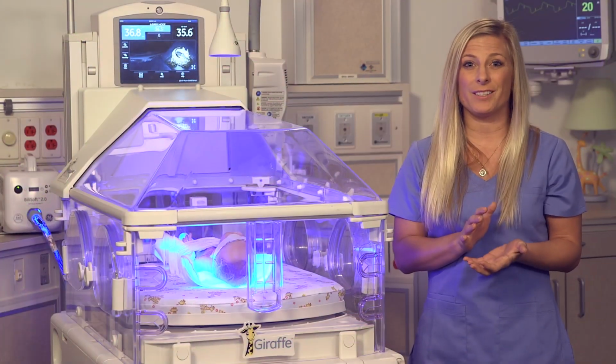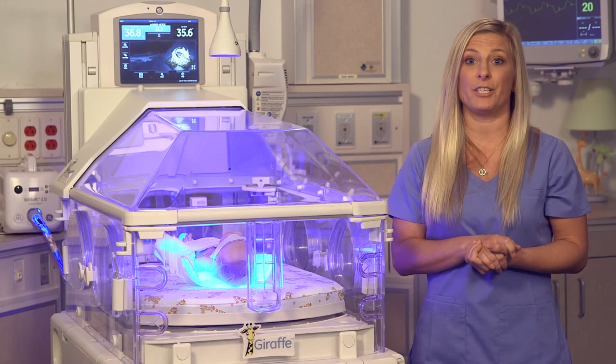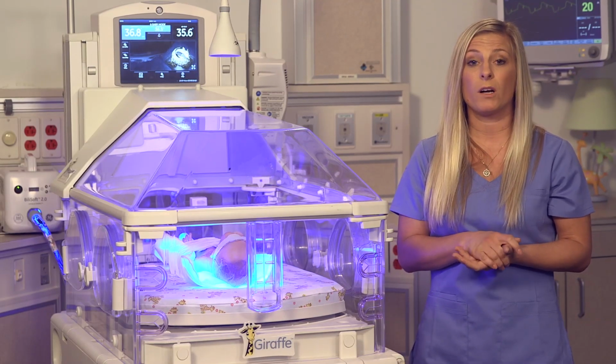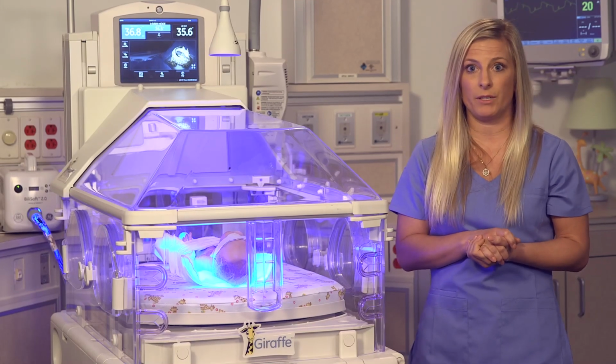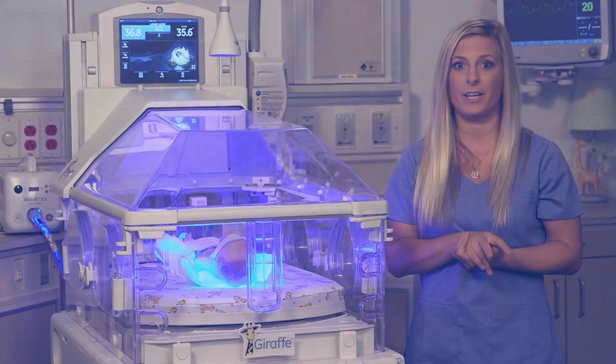So even though jaundice is fairly common and the treatment looks as simple as using a light, you can't imagine how many questions we get from customers on how to use our BiliSoft or our overhead phototherapy properly. Even when I walk into some units, I'll see a baby with 4 phototherapy lights on them, which is not necessary.